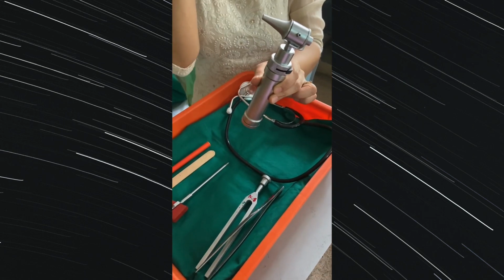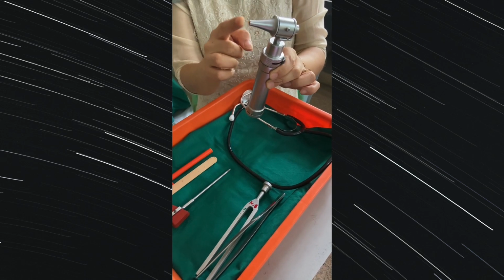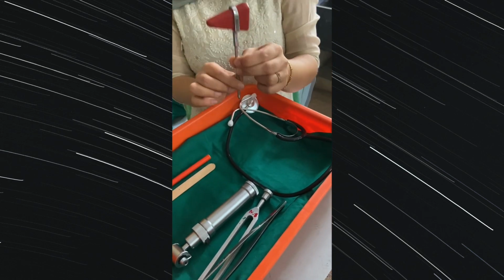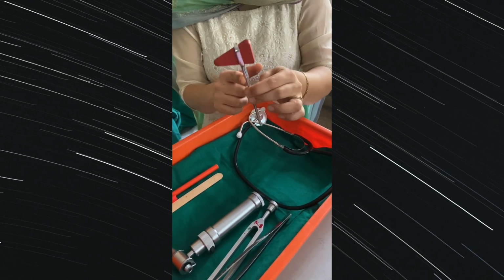Then this one is the otoscope. As you all know, I have covered in the Zoom session that we are going to go for the ear assessment with the otoscope, as we are going to look with a camera inside the patient's tympanic cavity. Then this is the knee hammer. As you all know, we are going to check the reflexes with this knee hammer, tapping on the tendons to assess the reflexes.